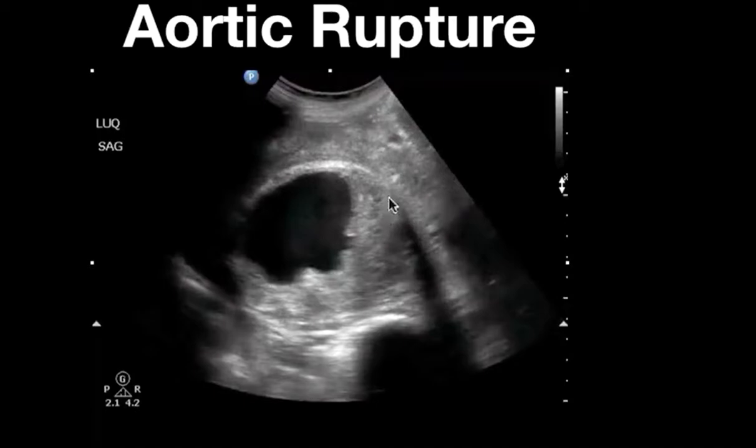Here's a patient with a ruptured AAA. You can see here, this is a well-contained fluid collection. This was a renal cyst. But if you look adjacent in that area, there's a rim of free fluid surrounding the kidney. That was retroperitoneal hemorrhage that had extended around the kidney from the ruptured AAA.